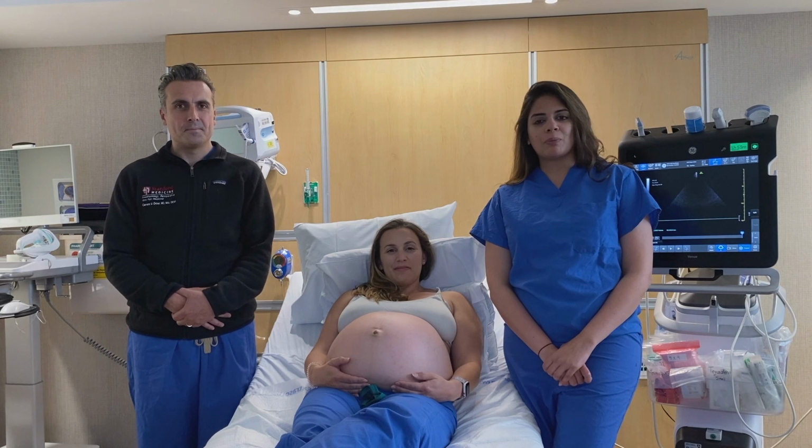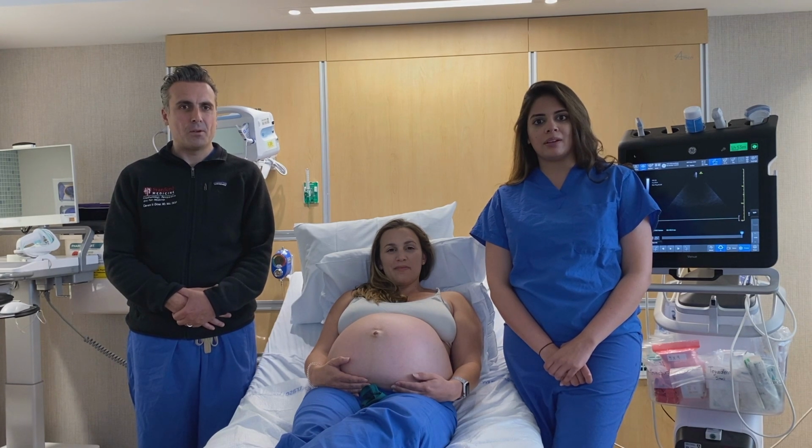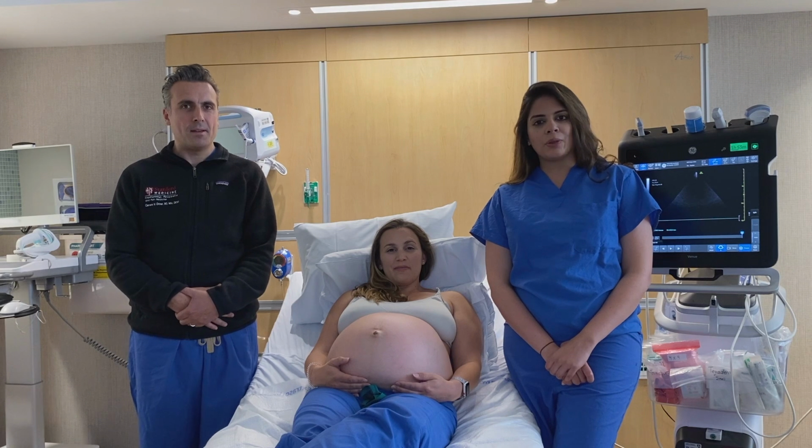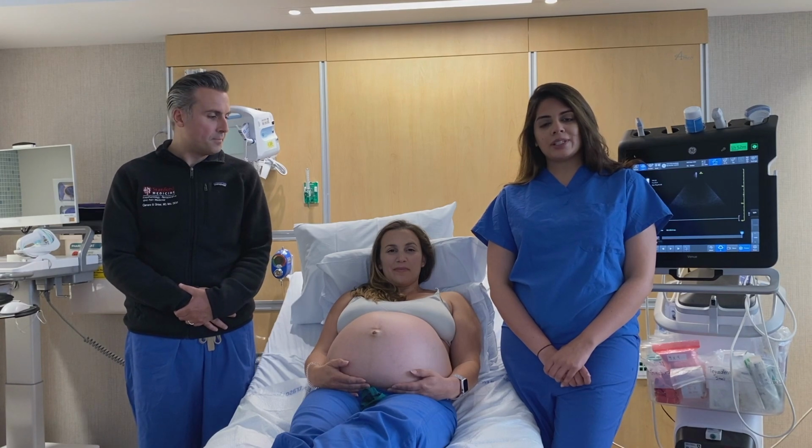Today we're going to cover point-of-care lung ultrasound in the pregnant patient. For more details on image acquisition and image interpretation, please refer to the other videos on pleural effusion, pneumothorax, and the clinical decision tree analysis. In general, the lung ultrasound exam is similar in a pregnant patient as it is to a non-pregnant patient. The areas to be scanned depend on the clinical situation and the diagnostic aim. There are 8 regions that are usually scanned, which are marked on the following image.